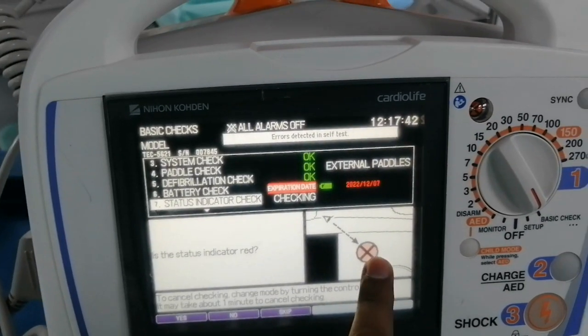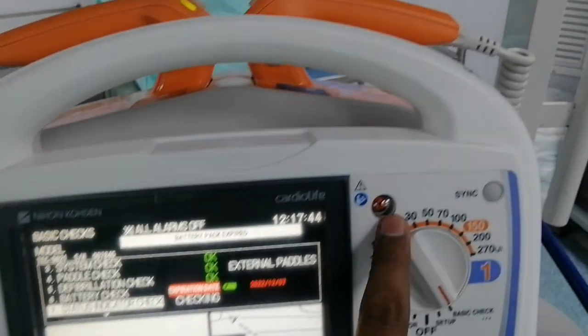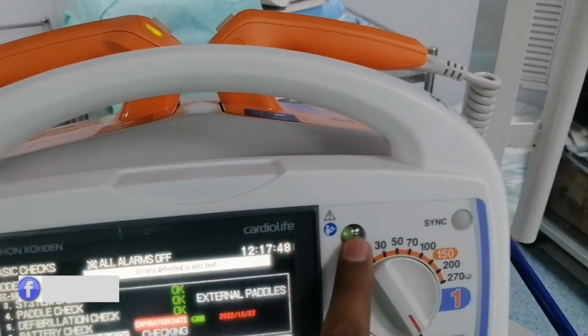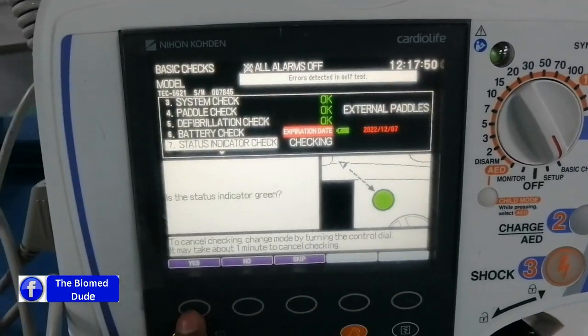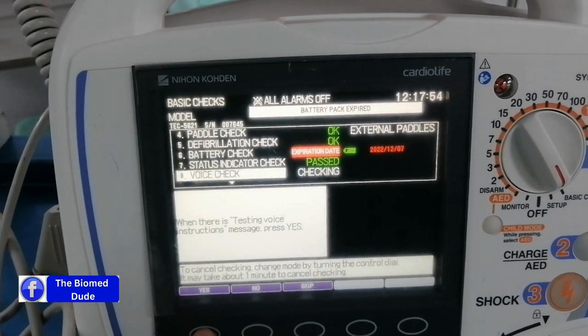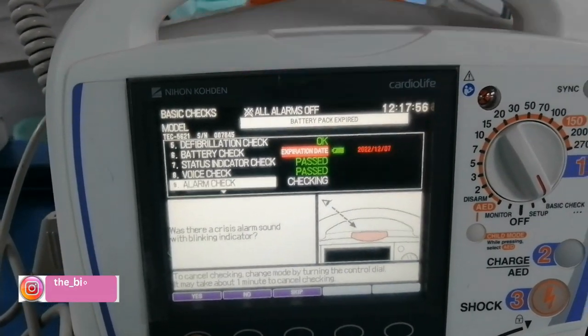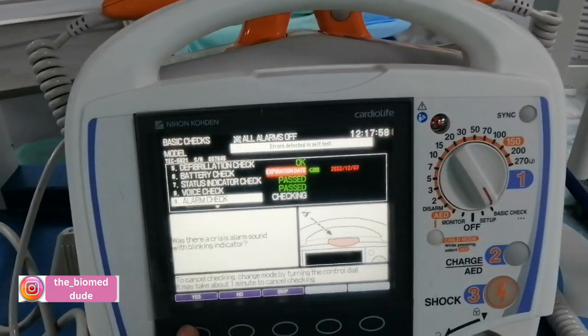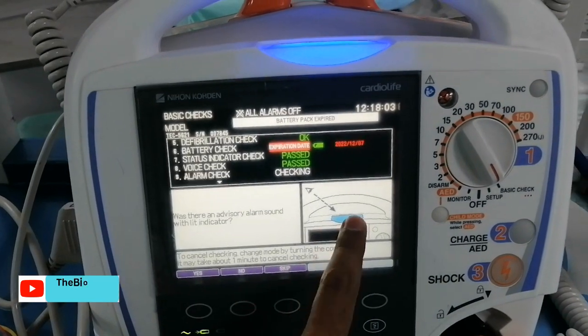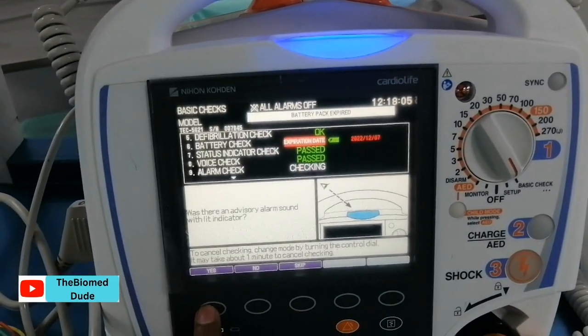Next is the indicator light check. The red light appears — I press okay. Then it turns green — I press okay. Next, testing voice instructions — the voice is okay. Then the alarm indication: red — okay. Next, yellow — okay. Next, blue — okay.